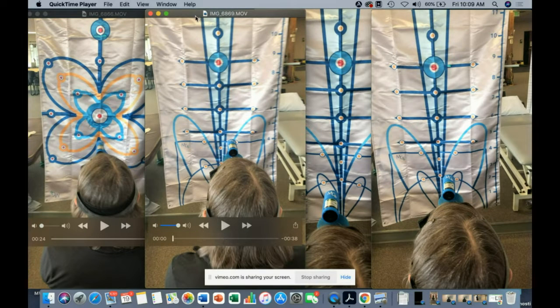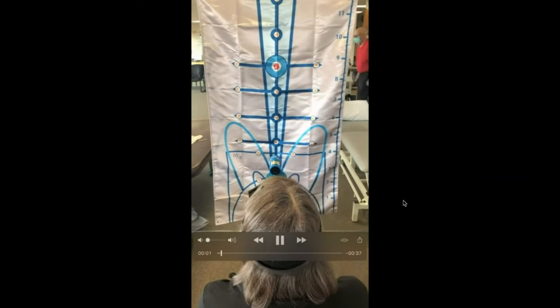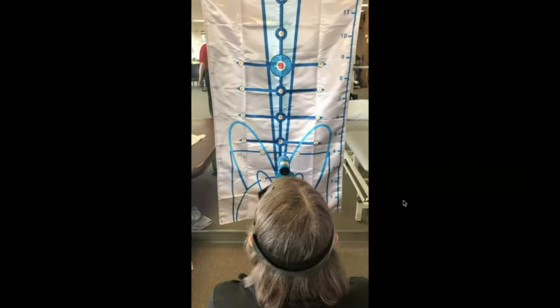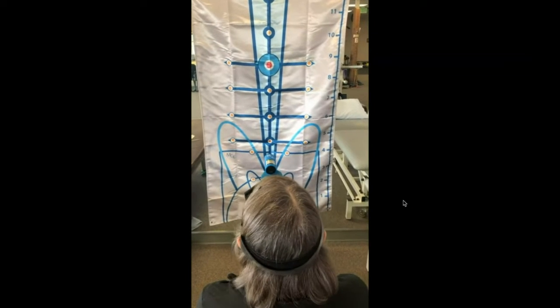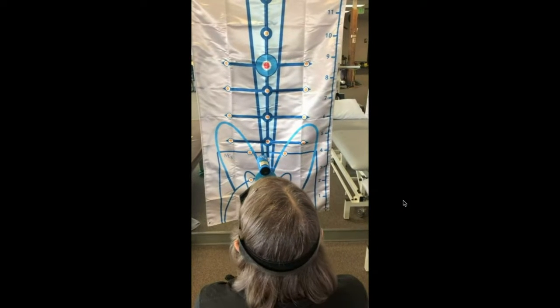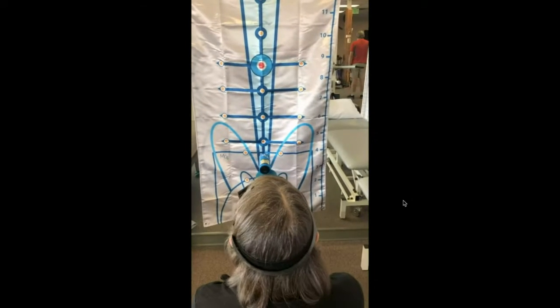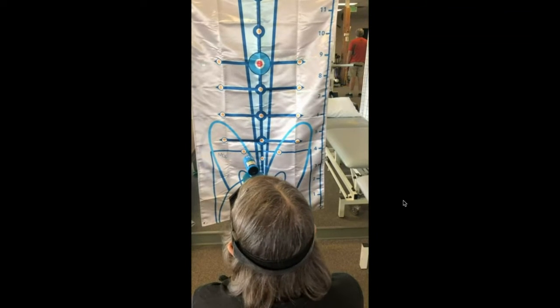And let's see how she does with this one. So let me just isolate this one a little bit, get rid of the audio again. And so as she starts to go back and forth with this one, she's looking at the orange target. And this is just a practice run of her understanding how far she needs to go to the right to have equal motion. And she just doesn't like to do it. So you'll see her pause a little bit and say, hey, I got to really get over there.